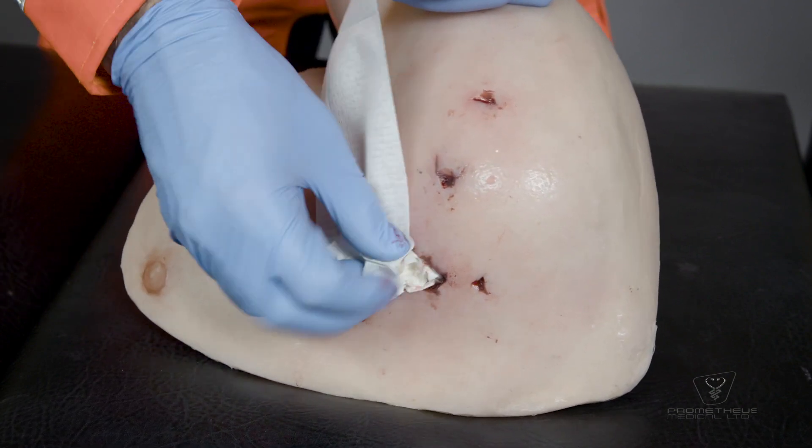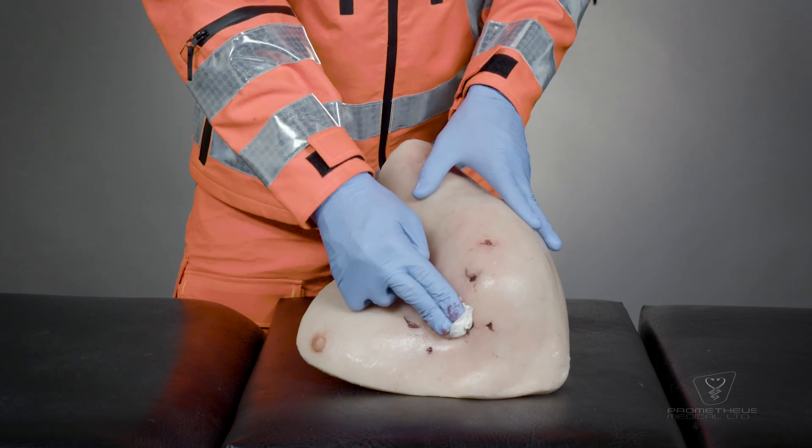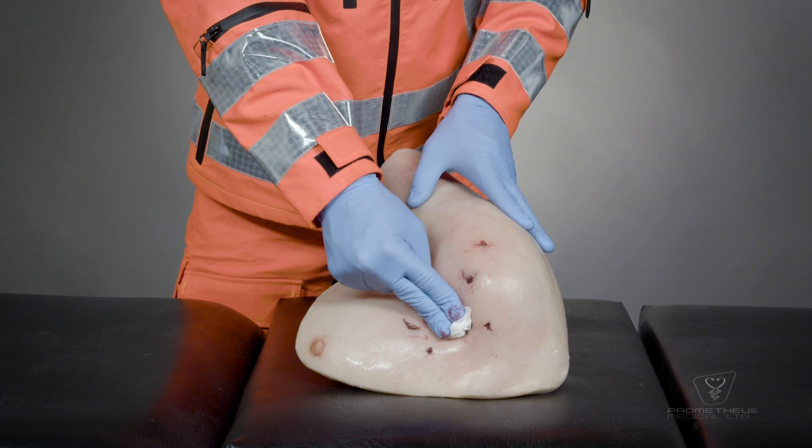You can use more than one dressing if required. Once fully packed into the wound, apply and maintain pressure until bleeding is controlled.